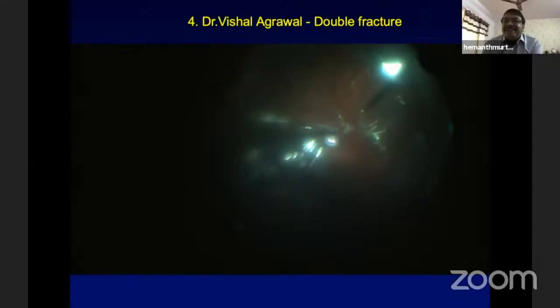That's why it's never good to reuse these cannulas because they are non-metallic. So they generally tend to fracture very fast. And because they are harder, I think it's best that we remove it like a foreign body first and then proceed with the surgery. Like how we would do a foreign body with retinal detachment. I think we proceed the same way so that we avoid iatrogenic trauma as it keeps moving around with the fluid. I think that would be a change that I would do.